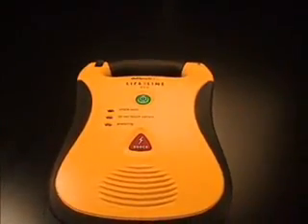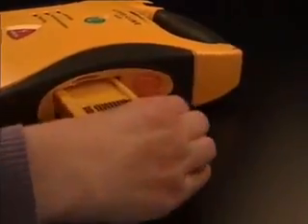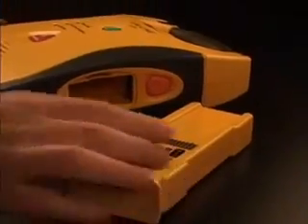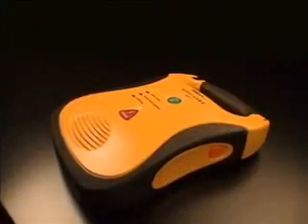Performing battery pack self-test. Battery pack OK. Remove the battery pack by pressing the battery eject button until the battery pack is partially ejected. The battery pack may then be completely removed by pulling it out. Always store the AED with the battery pack installed.